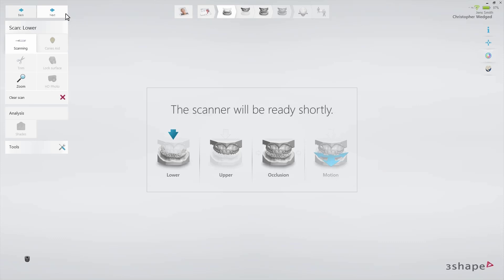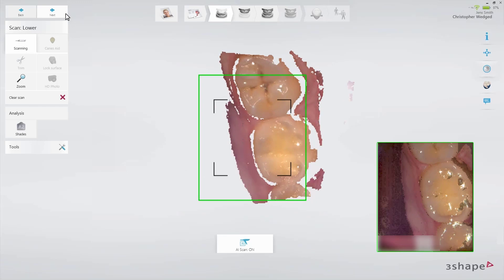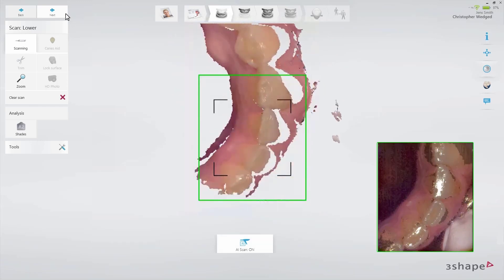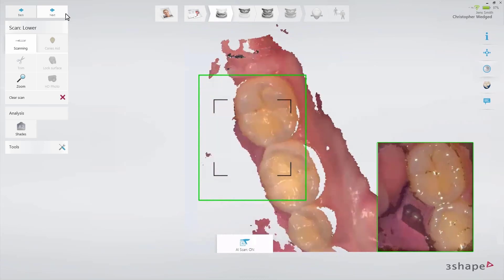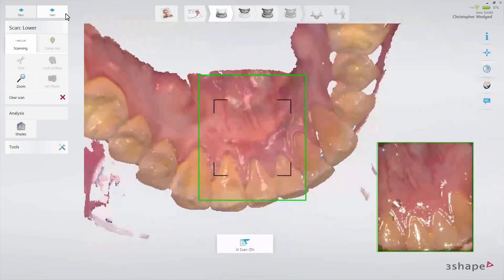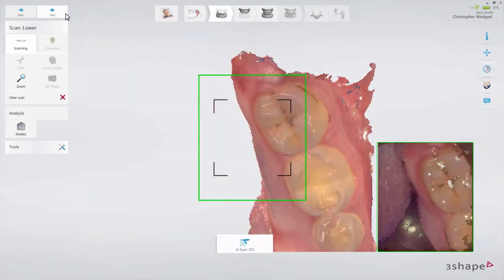Start by scanning the lower jaw following the recommended 3Shape Scan strategy: scan the occlusal surface from the molar to the canine. Wiggle the scanner when passing the centrals and continue until you reach the last molar. Roll over the last molar and turn slowly lingual until you reach the other side.